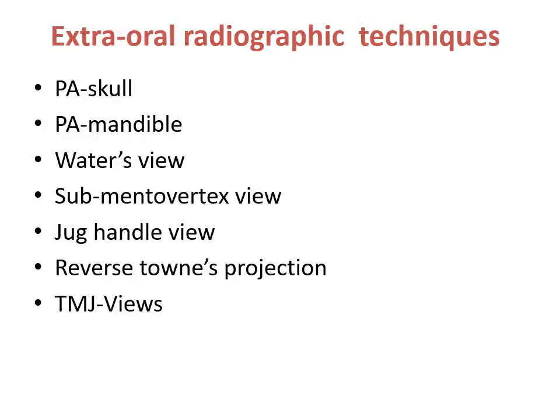These are the extraoral radiographic techniques: the postero-anterior skull, postero-anterior mandible view, Waters view, Sub-mentovertex view, jug handle view, reverse Towne's projection, and TMJ views. Today, except TMJ views, we are going to discuss all the other extraoral radiographic techniques.